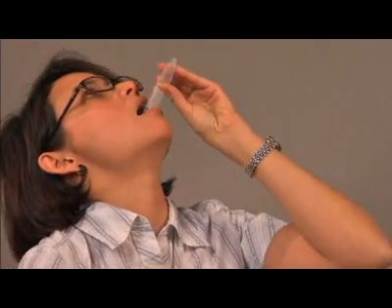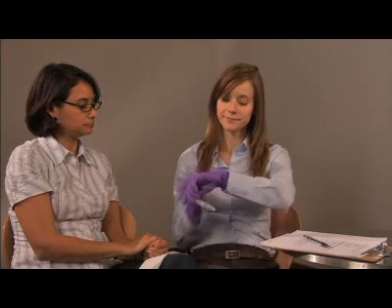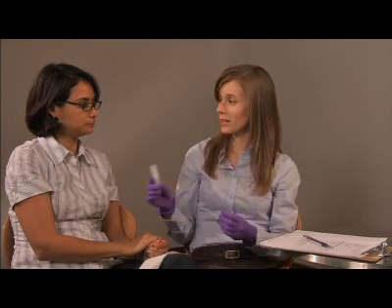And you want to take out that and put it underneath your tongue. Caution the participant to minimize contact of the swab with their hands. Direct the participant to gently chew in order to facilitate saliva production for approximately 2 minutes, ensuring not to directly chew on the swab. Instruct the participant to expel the cotton swab directly without handling it back into the labeled sample tube once it is soaked with saliva.